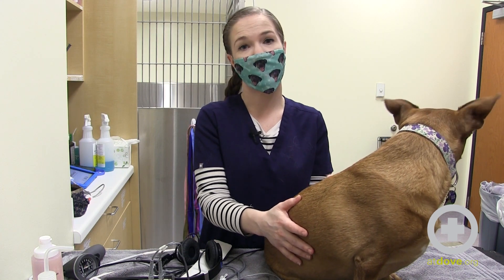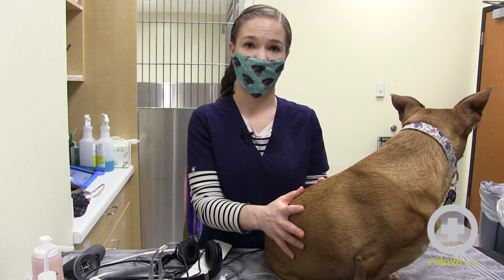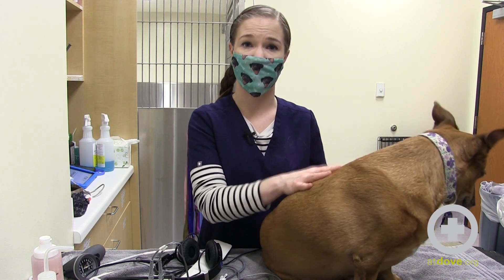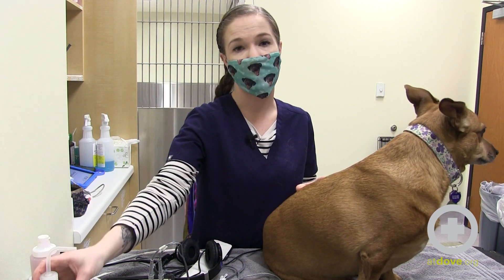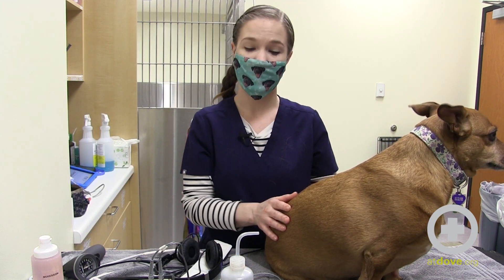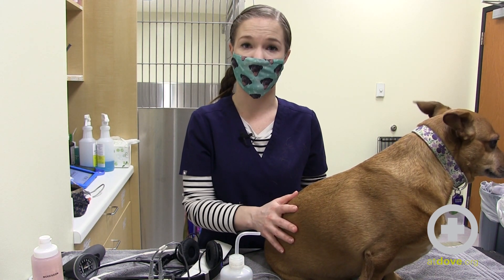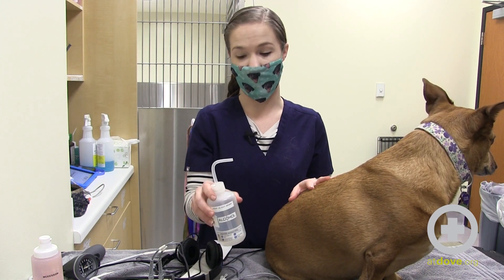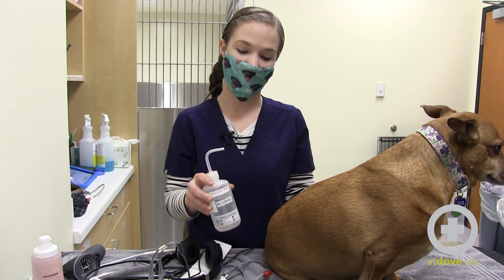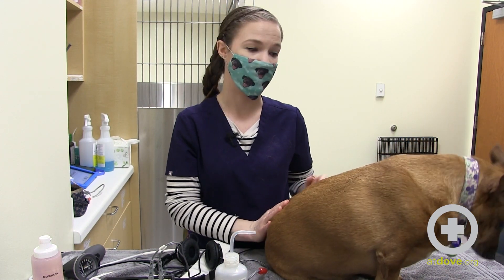Another tip, especially for dogs or cats that have very compromised systems — if they come in shocky and their pulses are already weak, we may not be able to palpate those pulses easily to help us find the vessel. One trick is to use alcohol. You're going to shave the area like we saw on Penny's foot and apply a little bit of alcohol directly to the skin — that's going to help locate that vessel a little bit easier. You never ever want to apply the alcohol directly to the crystal, as it will cause damage to the crystal. So the alcohol goes on to the patient's skin, and the ultrasound gel in a large amount goes on to the crystal.